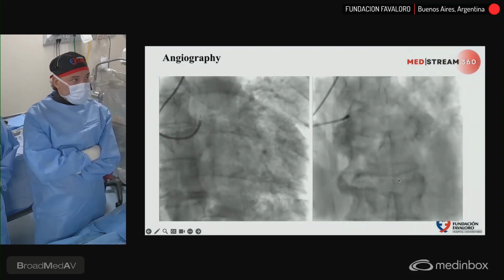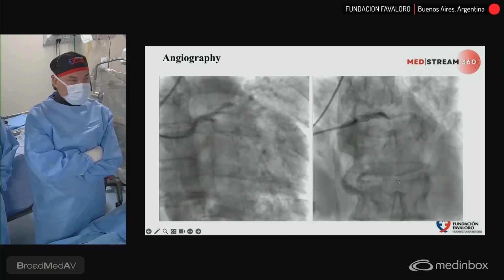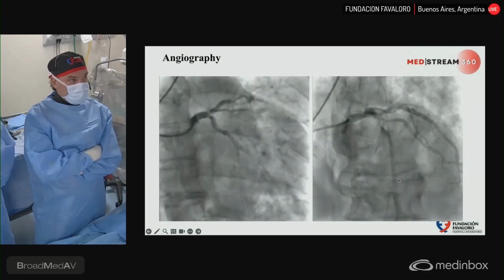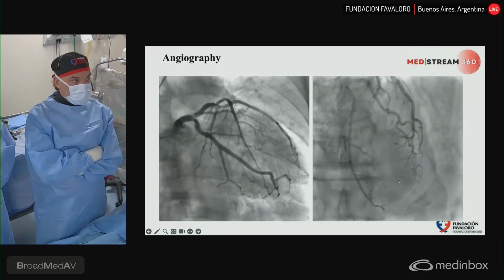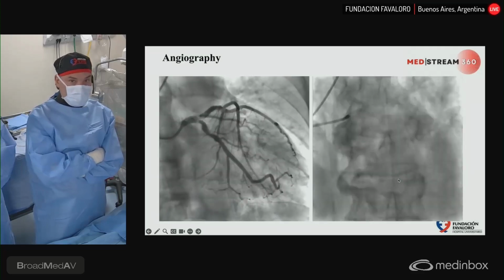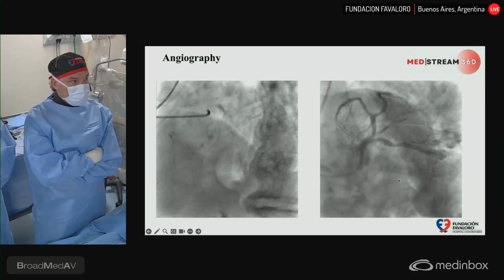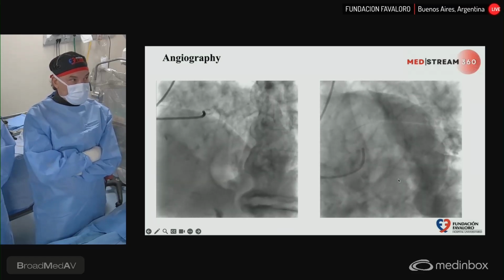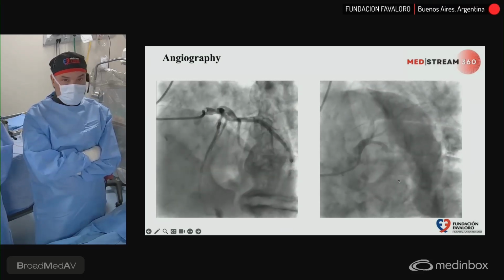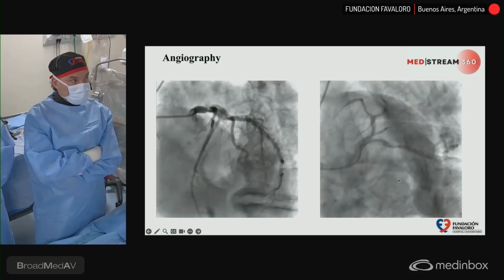Next. Here we can observe significant calcification on the distal left main and also the proximal LAD and the proximal circumflex. In this AP view, you can observe distally, immediately after this huge diagonal branch, a significant and calcified stenosis in the middle segment of the LAD. Next. On the spider view, we can observe a little better both ostia compromised, with this distal lesion on the left main better observed on the left panel, in this left anterior oblique inclination.